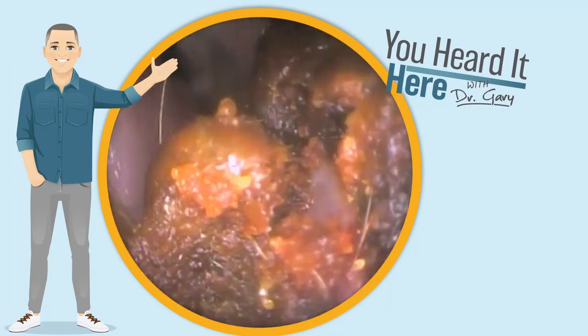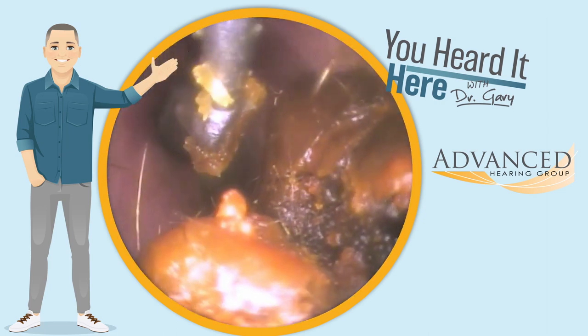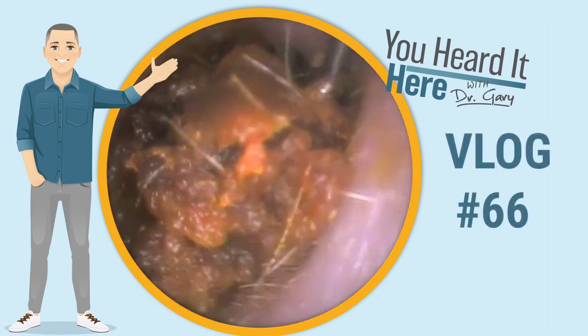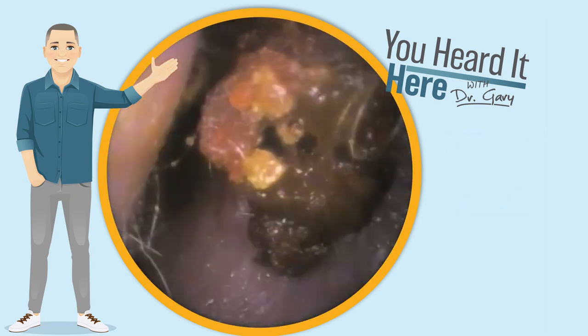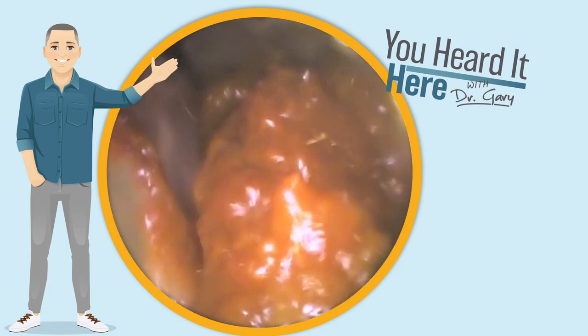Welcome back to You Heard It Here with Dr. Gary. I'm Gary, one of the clinical audiologists and part of the ownership team here with Advanced Hearing Group in Scottsdale, Arizona. This is earwax removal vlog number 66. In today's episode, I'm going to use the curette to remove some large chunks of wax from the ear and then finish it off with a little bit of irrigation just to clean the ear canal walls.